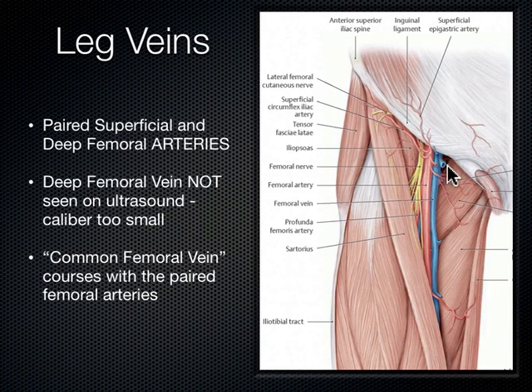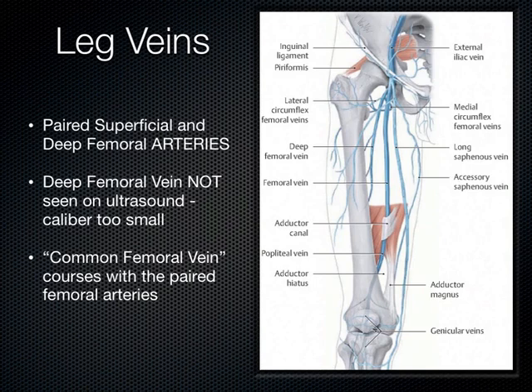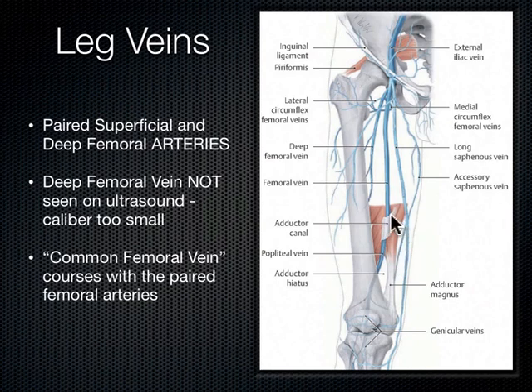Right away you'll see a branching of the femoral vein into the superficial and deep femoral veins. The deep femoral vein is a very small-caliber structure — it's really hard to see, and as soon as it dives down to the bone you don't see it anymore. Because it's small caliber, it's not that clinically relevant even if it has a DVT. You will see the common femoral artery bifurcate into its superficial and profundus arteries, and those structures are very visible. The vessel then dives into the adductor canal about two-thirds of the way down, which takes even experienced hands an additional 10 to 15 minutes per leg to visualize.